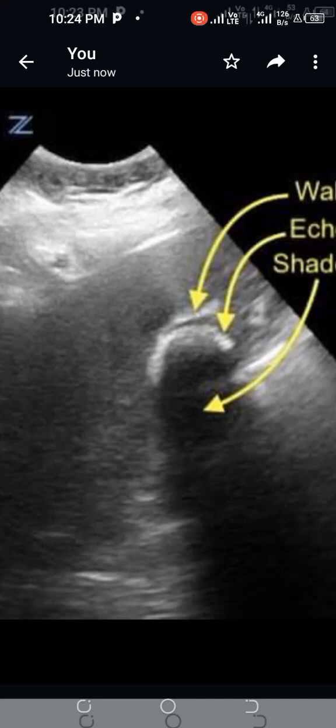Hi, my name is Dr. Muhammad Irfanda. Today I would like to describe the ultrasonographic signs of the gallbladder. The sign shown here is called the Wall Echo Shadow sign.